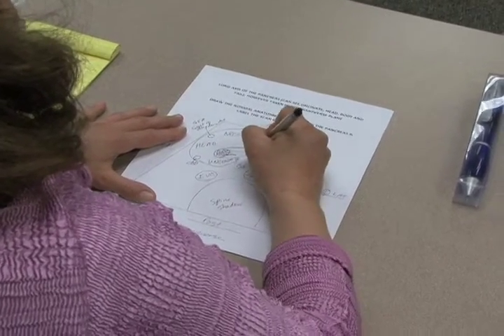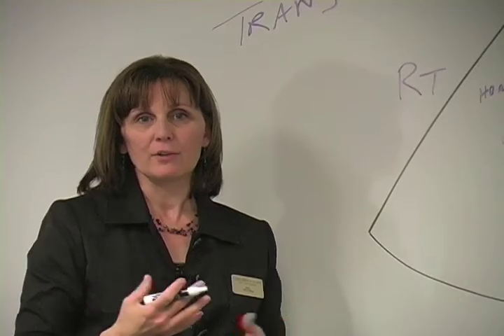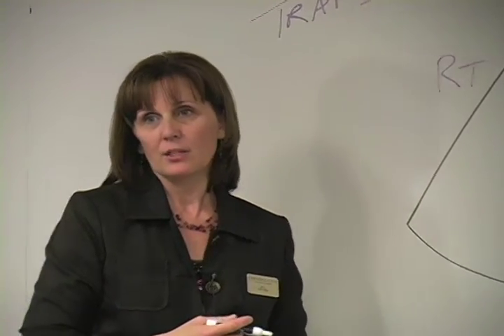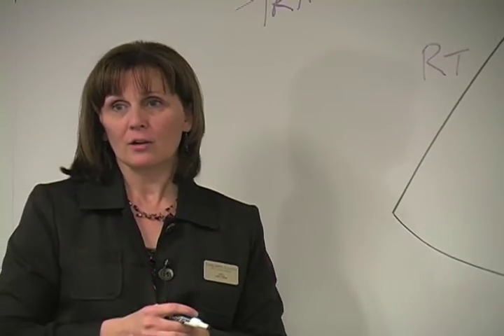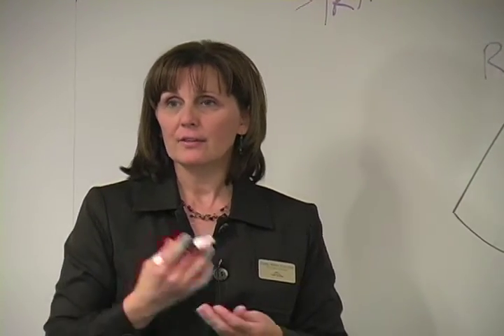So when we're looking at the pancreas, we're trying to rule out any abnormalities or any disease, make sure there's not carcinoma in the head of the pancreas. The main goal for ultrasound is to let the doctor know if there is abnormal variances or if there's abnormalities, where is it located?